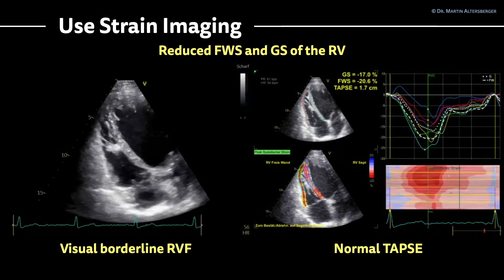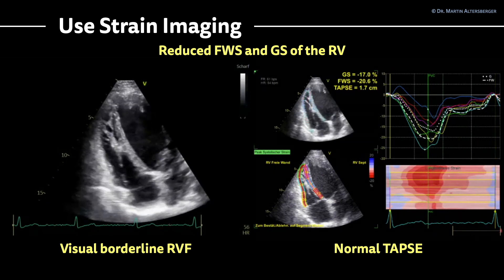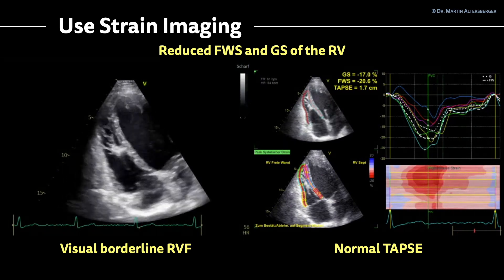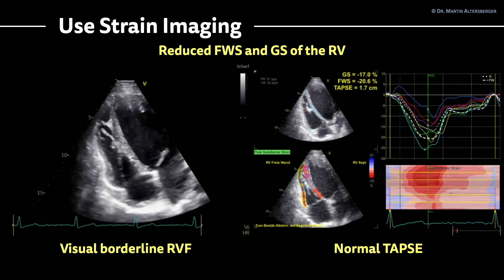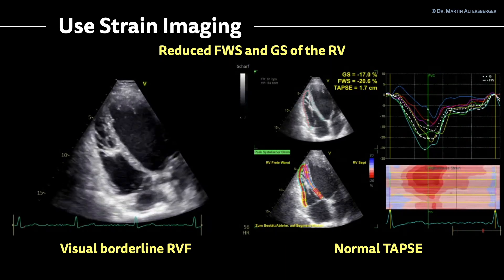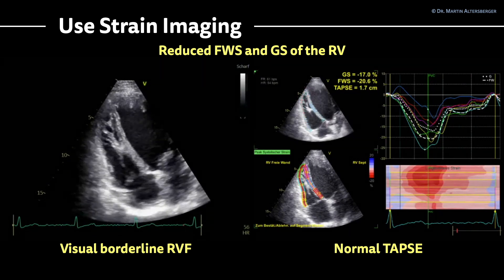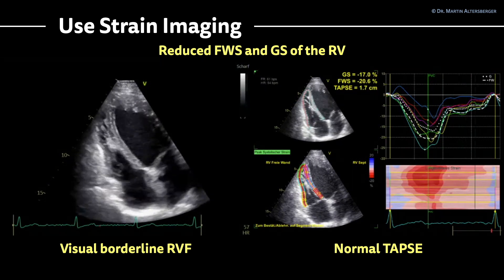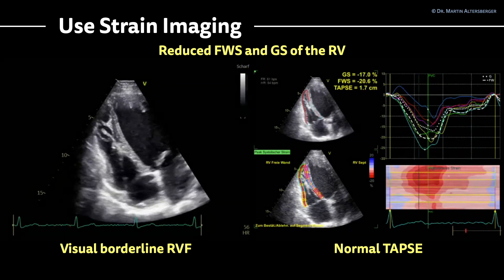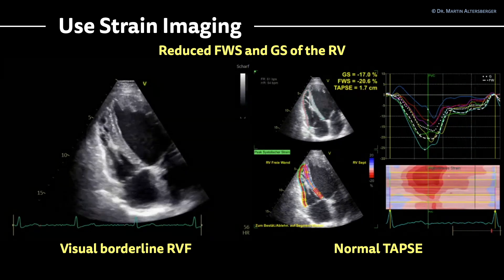Using strain imaging of the right ventricle, both the free wall strain and global strain are reduced. The free wall strain is approximately minus 20.6 to minus 21 percent, which is mildly reduced. The normal value for young healthy individuals would be in the range of minus 23 percent.